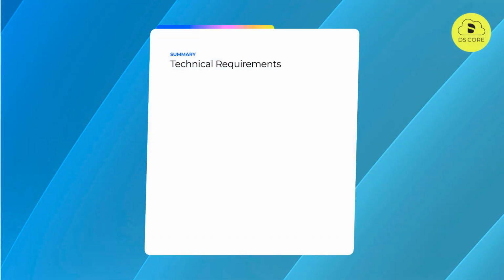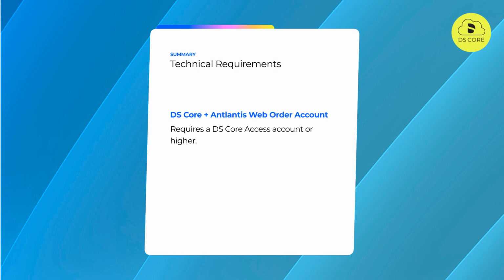Please note this workflow requires a DS Core Access account or higher and an Atlantis web order account, as well as a manual account synchronization step by a Dentsply Sirona customer service agent.